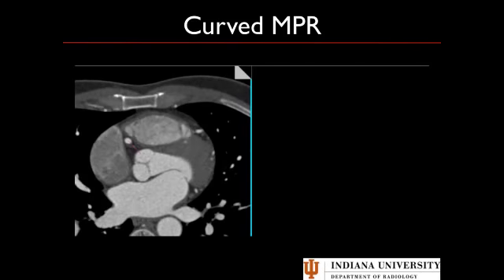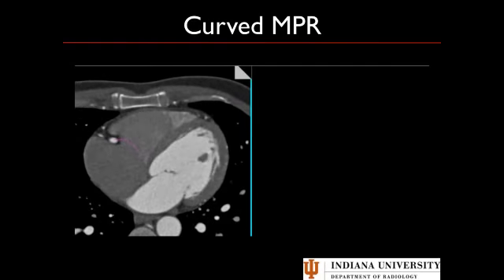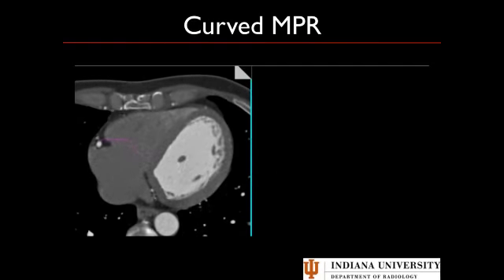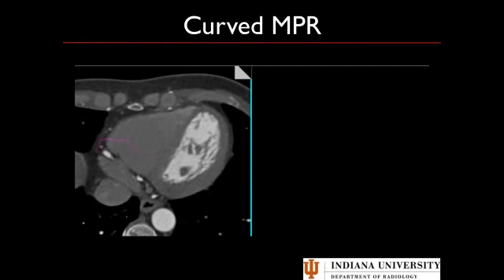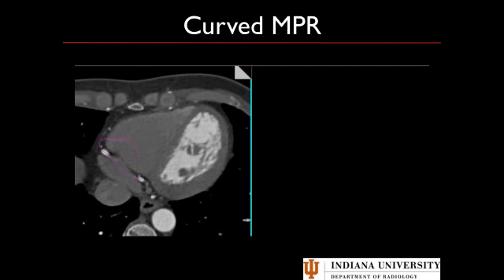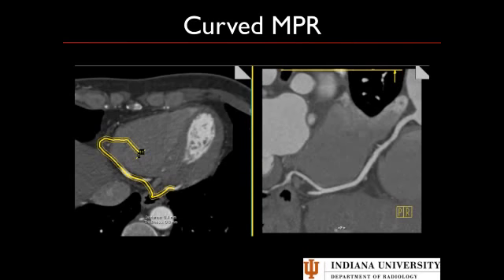Here we demonstrate making a curved MPR — something your techs will generally do for you, but it's worth knowing. We just follow the right coronary artery down, clicking along it on the axial images, and once we reach the bottom we have an MPR. You can make multiple parallel MPRs to have a stack to evaluate. Remember, at least in the United States, you need to reconstruct MPRs and store them on PACS to get paid for a CTA exam. It also helps communicate with referring physicians to demonstrate where a stenosis is.